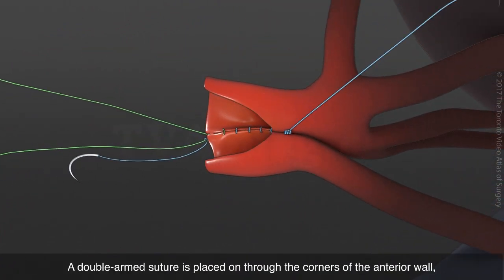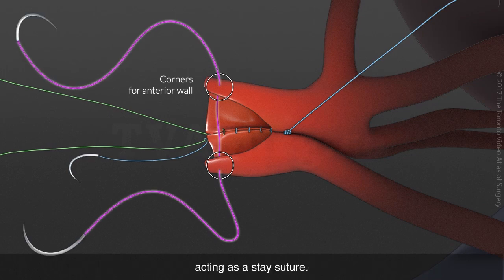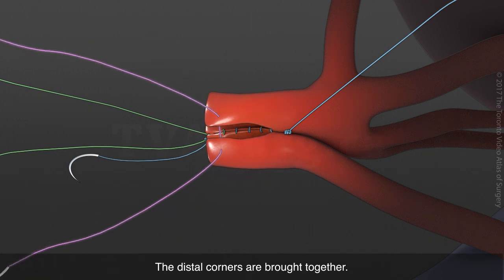A double-armed suture is placed through the corners of the anterior wall, acting as a stay suture. The distal corners are brought together.